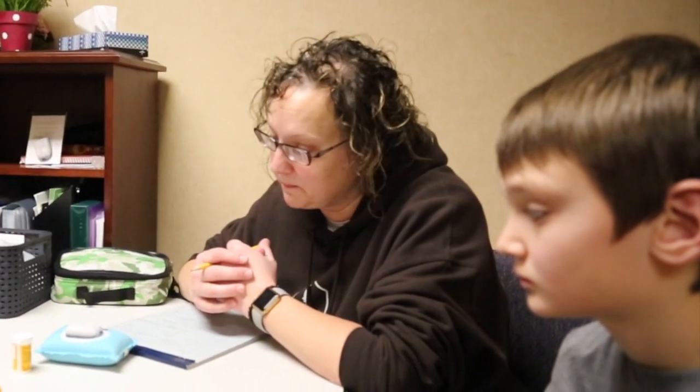We want kids to be kids. You still have to count your carbs. It does not know how many carbs you're eating. So that process does not go away. But instead of you doing the math, the logbook, with that sort of thing, you'll enter it into here.